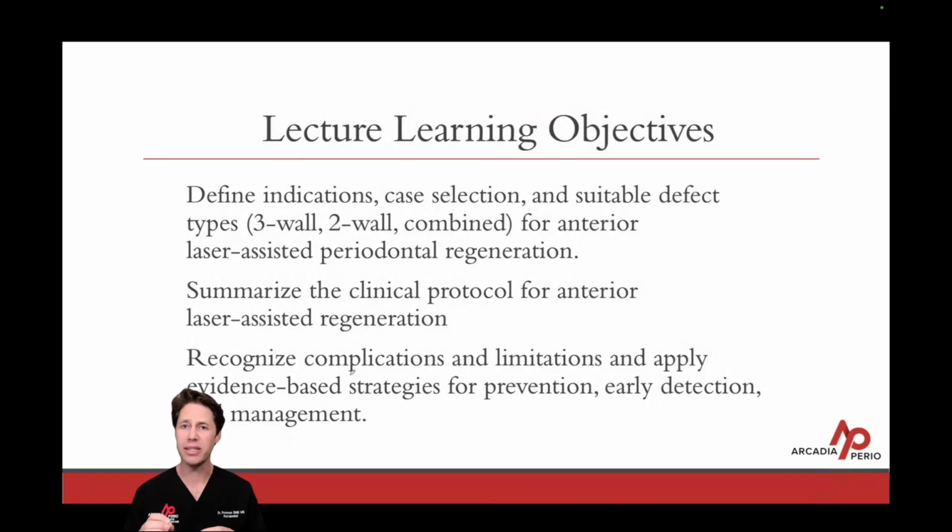I'm going to be able to summarize the LANAP protocol. And remember, I'm going to use LANAP and laser assisted regeneration interchangeably. But I want to define those concepts right now. Laser assisted regeneration is the LANAP protocol. However, laser assisted regeneration is for site-specific areas. When I'm referring to LANAP, I'm referring to a full mouth disease protocol typically treated in one sitting. I want you to finally be able to recognize complications, limitations, and apply evidence for early detection and proper management.